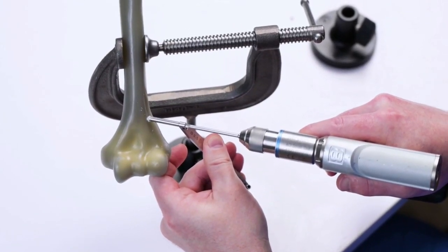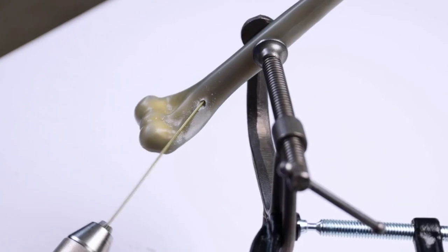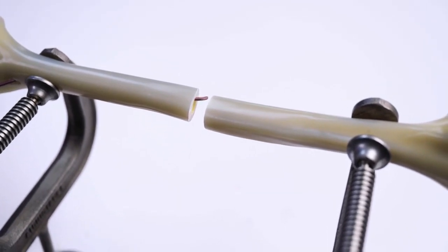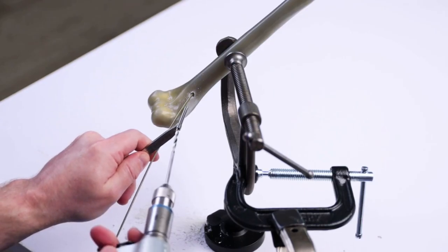A lateral approach to the distal humerus is utilized. The first flex nail entry point is created above the olecranon fossa. The first C-shaped flex nail is passed into the intramedullary canal. Rotation of the flex nail aids in passing it across the fracture site and obtaining a preliminary reduction.